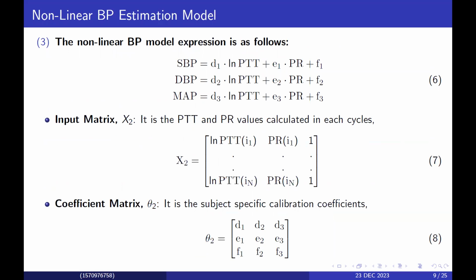Similarly, we define a nonlinear BP estimation model also. Here we can see that the only difference is that instead of PTT, we take the logarithm of PTT. Other than that, everything is the same. So here also we define the input matrix, coefficient matrix, and output matrix.